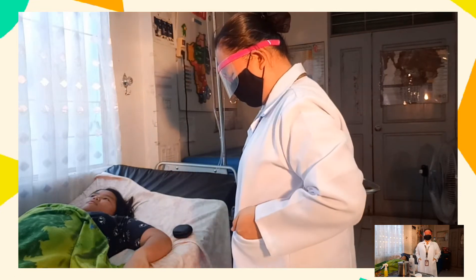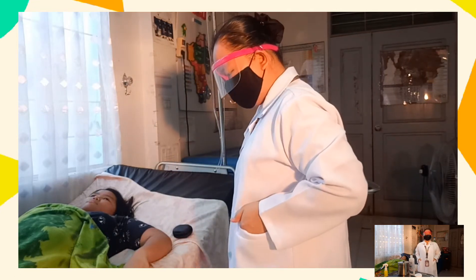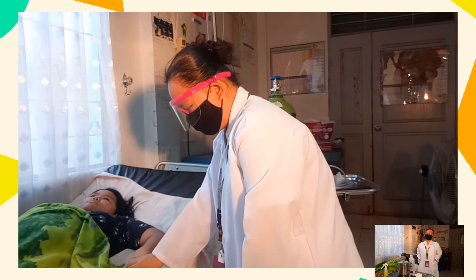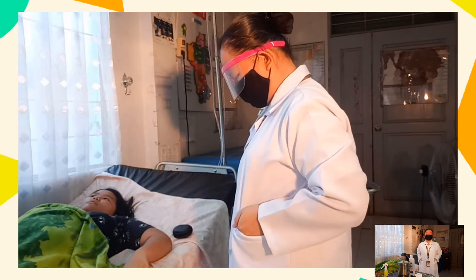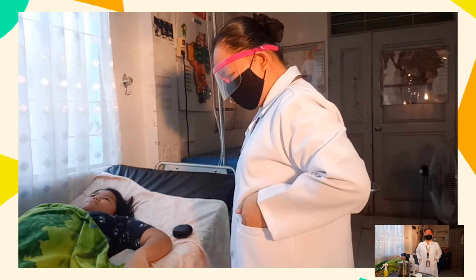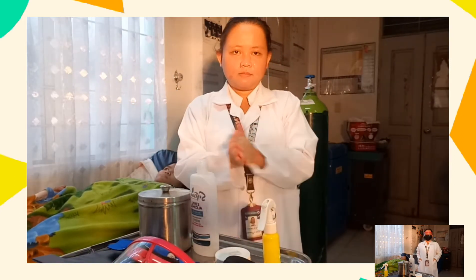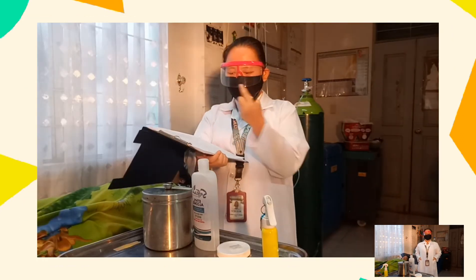Reassess the patient's respiratory status, including respiratory rate, effort, and lung sounds. Note any signs of respiratory distress such as nasal flaring, use of accessory muscles, or dyspnea. Remove PPE if used, perform hand hygiene, and document the procedure.